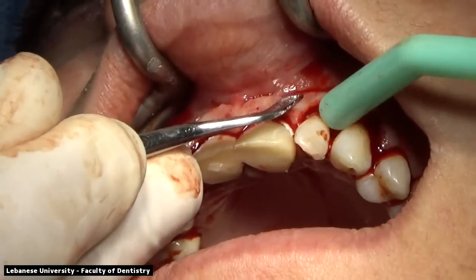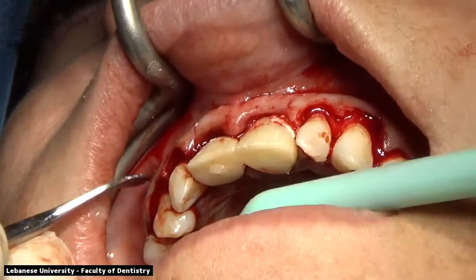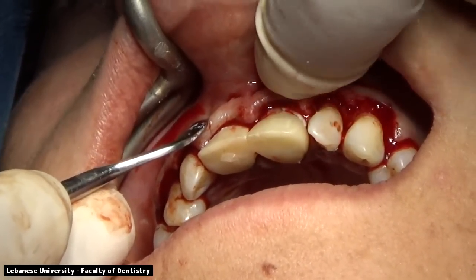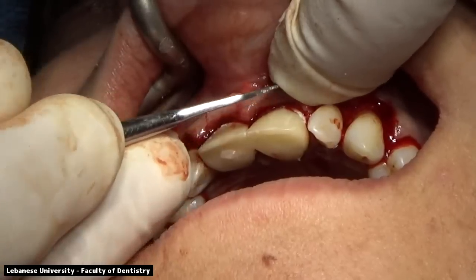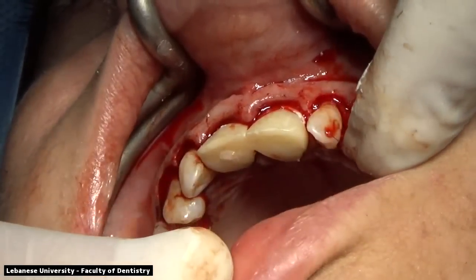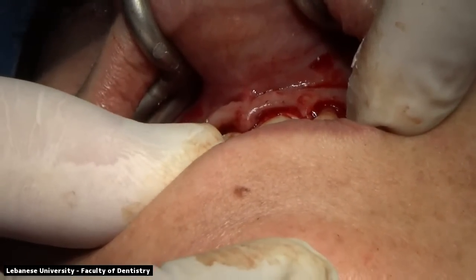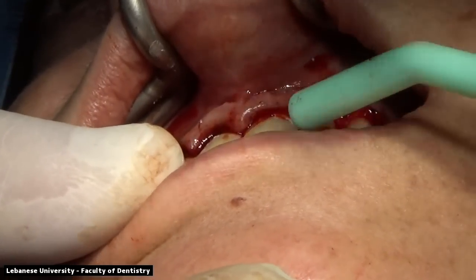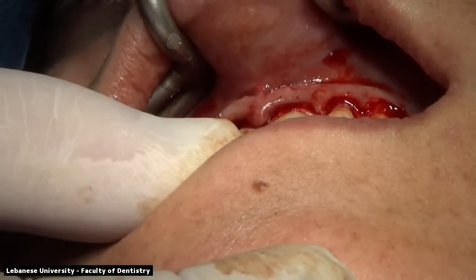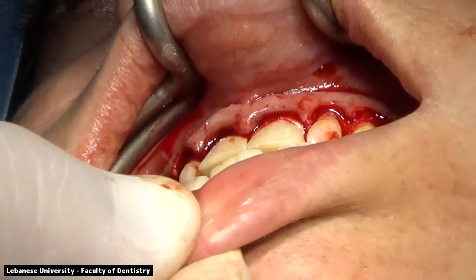We're adapting the flap to the surface, and we're waiting for the acrylic material to set completely before removing it. This will give us the shape of the inner surface of the soft tissue. It will allow adaptation of the soft tissue to the temporary restorations without gaps so that we don't get any seepage of the blood on the sides. Scalloping of the soft tissue on the temporary restoration is very important for long-term soft tissue profile.